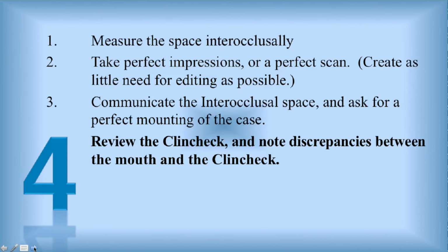And now that we have ClinCheck Pro, there's the added tool of being able to see where the occlusal dots are. So when you take that open bite impression, you can mark those dots on your photographs. And when you send your photographs, you'll have your occlusal dots in there, and you can make sure that they match. Now that's a process that most of the doctors are not used to going through, being so precise, because they rely on the computer, they rely on a line to make sure that it's mounted correctly. But the computer doesn't know that you have an open bite, and so you can't get around to making the assurance that your ClinCheck actually matches what you've got.